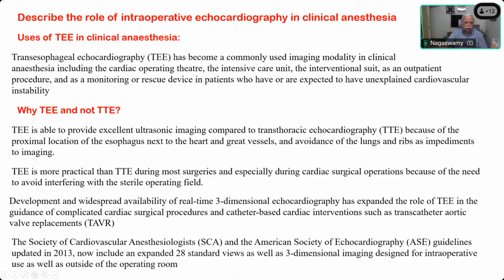And the Society of Cardiovascular Anesthesiologists and the American Society of Echocardiography guidelines, updated in 2013, now have an expanded 28 standard views as well as three-dimensional imaging, designed for intraoperative as well as outside the operating room work.